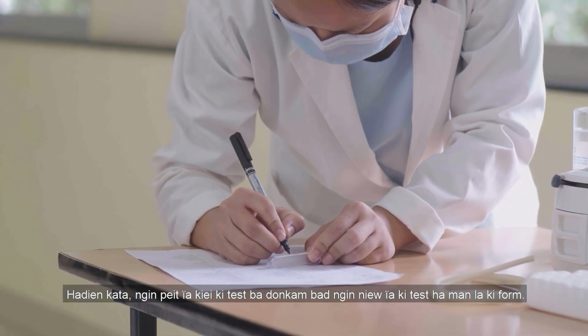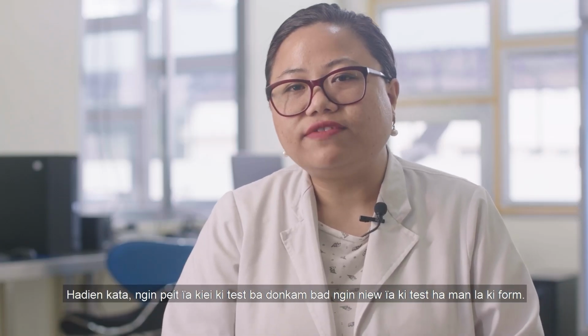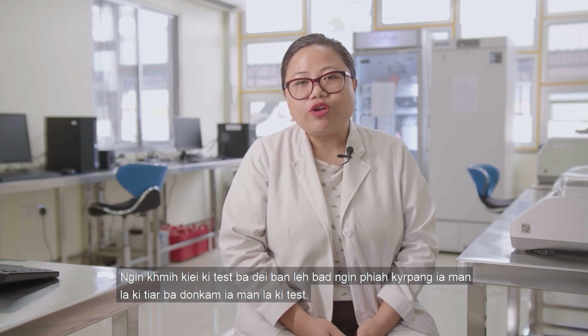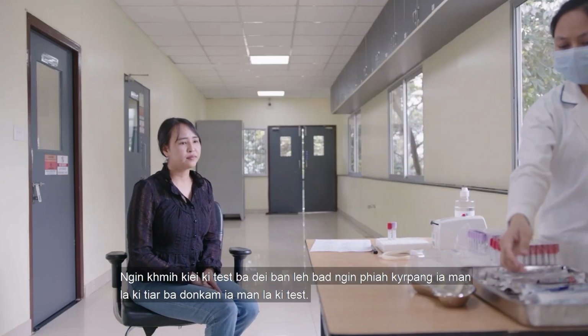Next, we'll look at the test that is going to be required, and we're going to count the number of tests present for each requisition form. We're going to map out what tests are required, and we are going to separate the different types of consumables that will be required for each test.